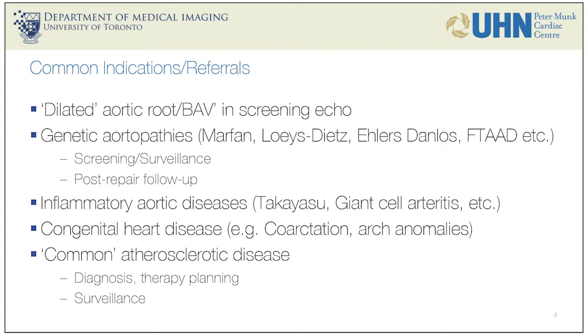And this is not necessarily the order of the percentages of what people are coming to us in terms of imaging questions, but a very typical aspect is something like there's an echocardiography done, we see some dilatation of the aortic root, please assess further. May have only been a screening echo, might have been a bad echo, but then those patients come into CT or MR, most often MR, because young patients, they may have some valve disease as well, and that's all you get in terms of the clinical information, and to further assess, especially the thoracic aorta, with a focus on the ascending aorta as well.